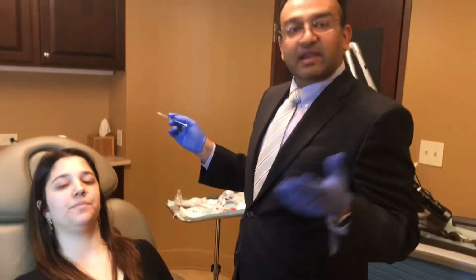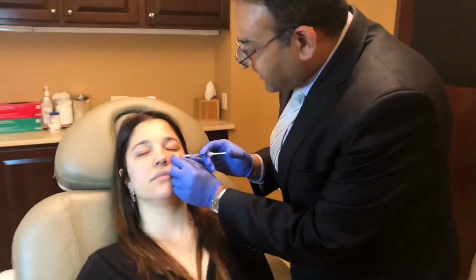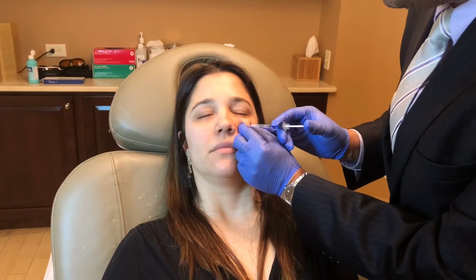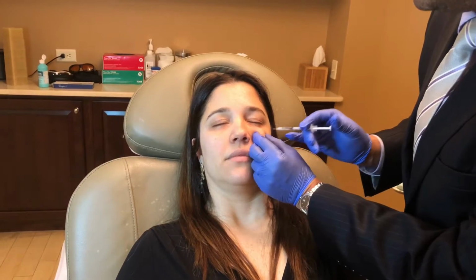So now we're going to come over to her left side, and basically it's the same procedure. So Veronica, what you're going to feel initially is a pinch. 1, 2, 3, pinch. That's it, and a little bit of burning. Take a deep breath. That's the worst part. Almost done. Couple more seconds, and that's it. Good job.